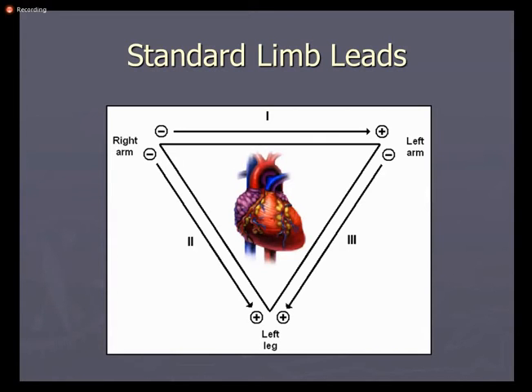Now, it is a very important slide. Limb leads: what we do is put a lead on the right arm or left arm.